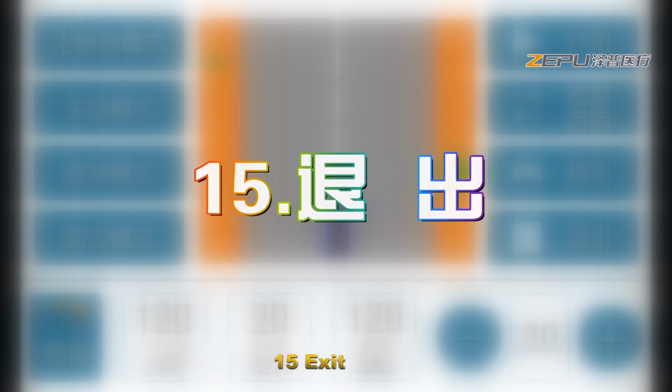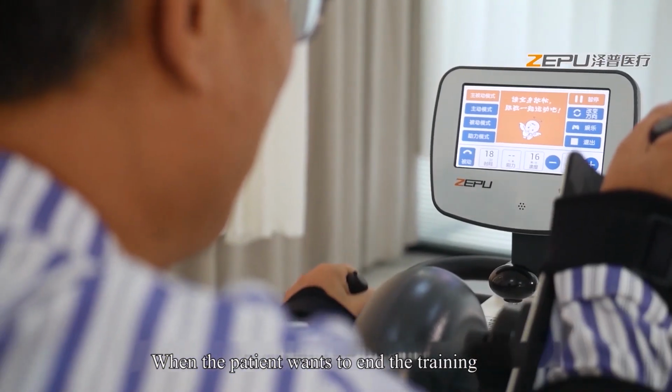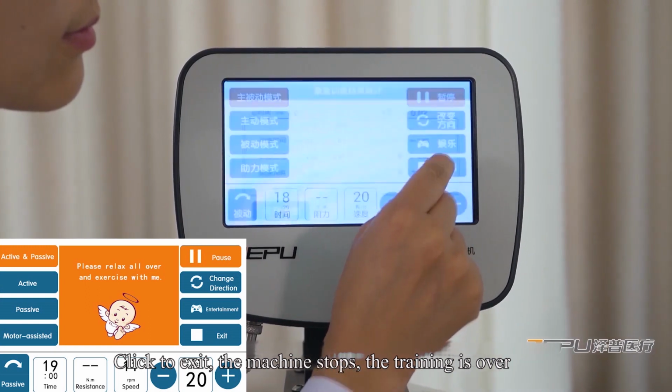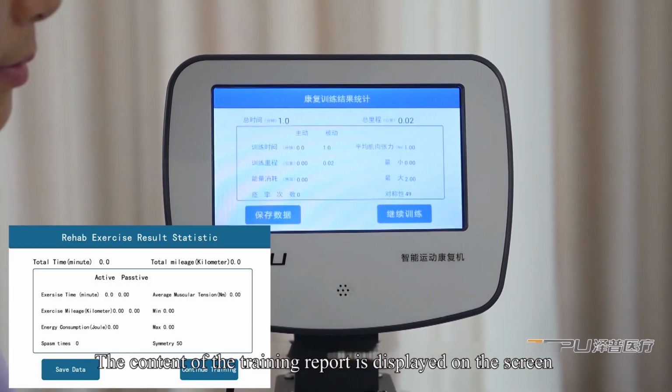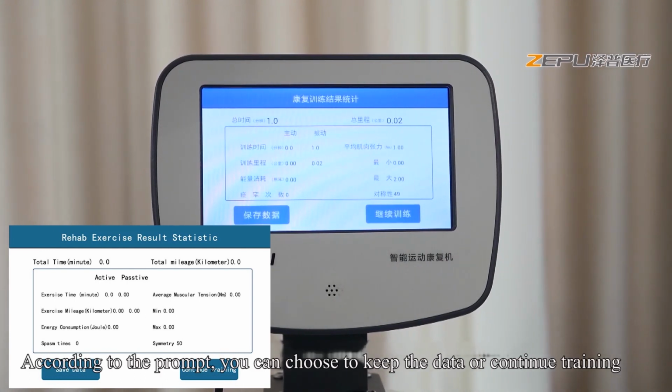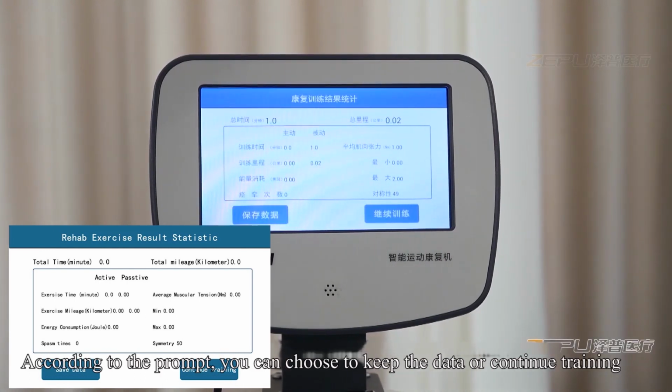15. Exit. When the patient wants to end the training, click to exit. The machine stops. The training is over. Content of training report is shown on the screen. According to the prompt, you can choose to keep the data or continue training.